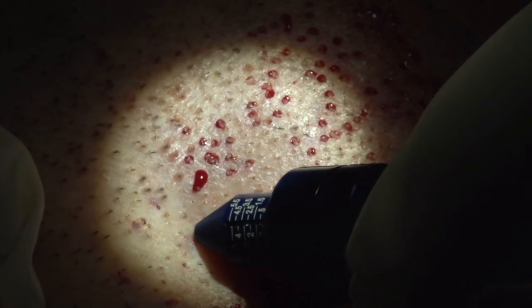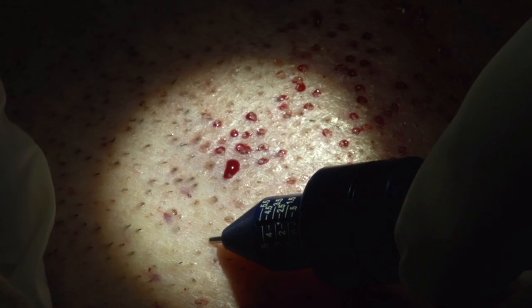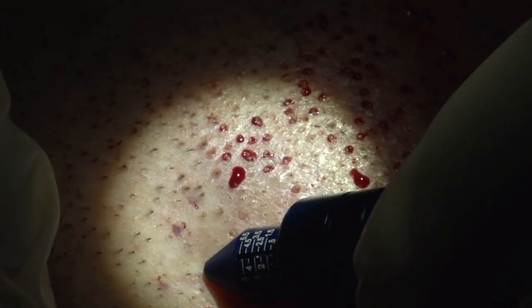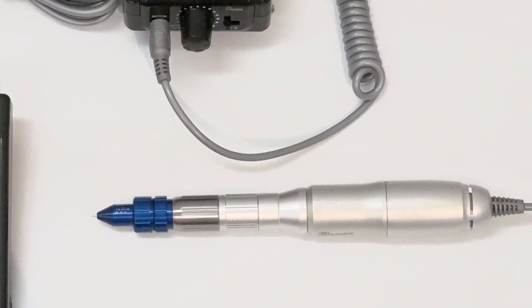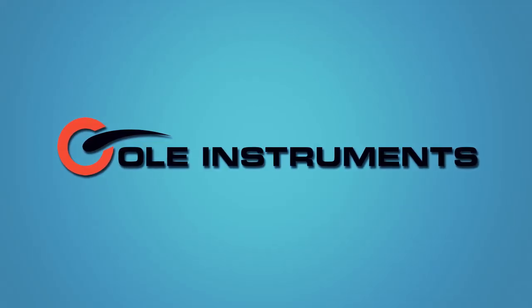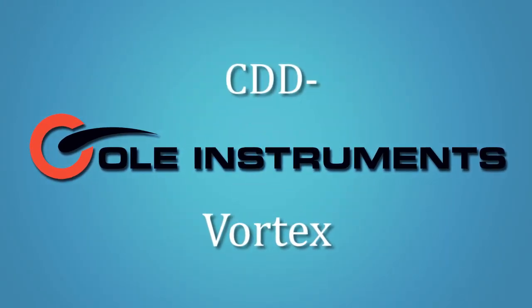The Vortex Cole Dissection Device features Dr. Cole's user-friendly patented depth control tip and is the only device available with this feature for less than a thousand dollars. This Vortex is available exclusively through Cole Instruments and is backed by our one-year warranty.